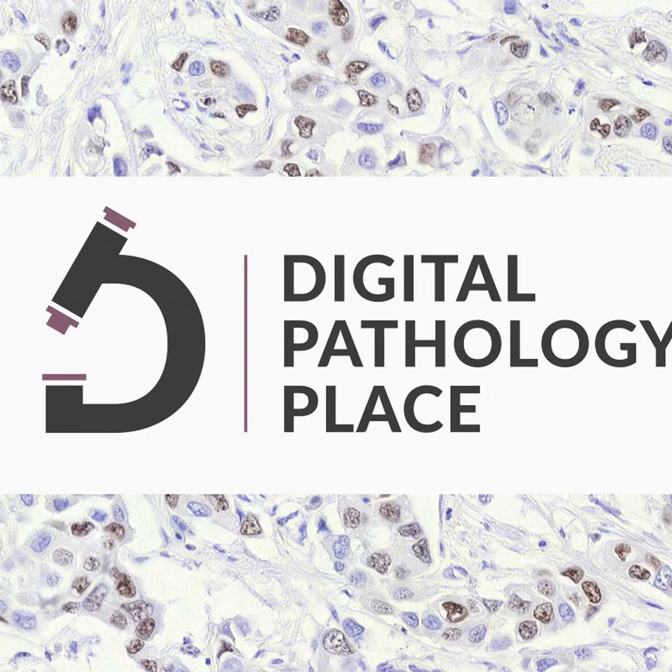I personally have a strong opinion on visual scoring: until we had good image analysis, it was as good as we could get. But the strong opinion is basically about the physiology of human vision. You can only estimate, and if you need a precise cutoff and need to decide whether a biomarker level is below or above this cutoff, there's always going to be a 50-50 chance that you're going to be wrong around the cutoff if you're doing it visually, right?